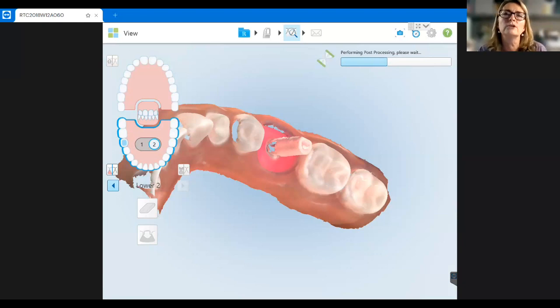Okay, question. Are you saying to complete the scan body scan, you can remove the scan body to pick up the adjacent proximal? Would the scanner try and erase the scan body? In my experience, yes, you can remove the scan body. I don't want you to hover over top of the implant site though.